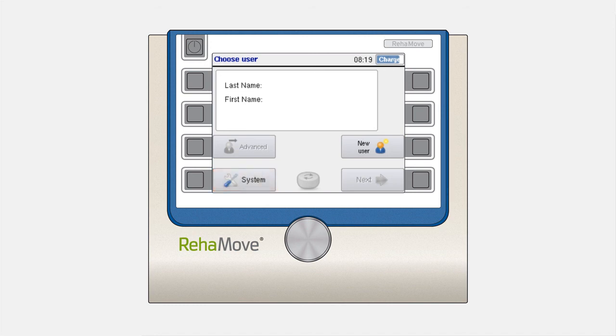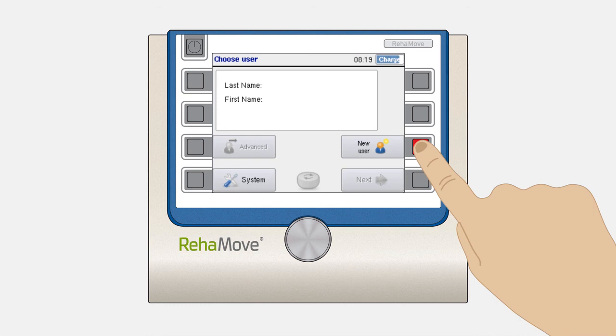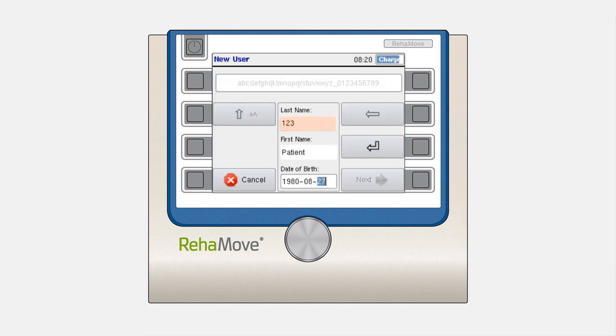To create a new user, please press the third button on the right. Enter the last name, the first name, and the date of birth of the patient. Please enter at least three letters or numbers for each line.